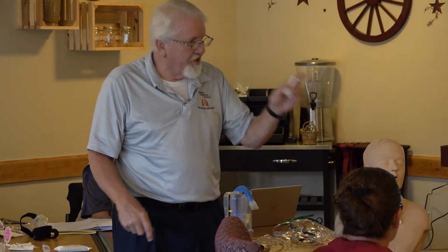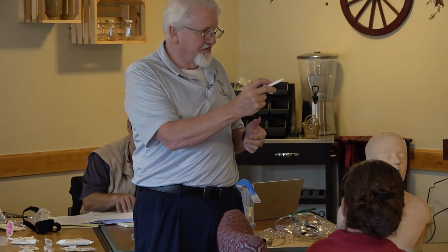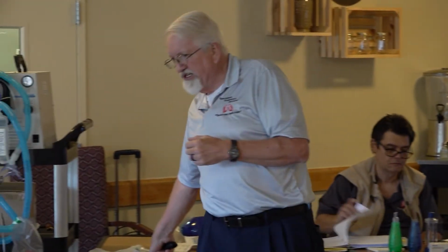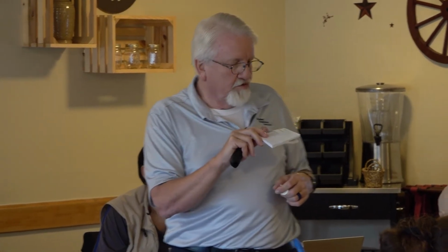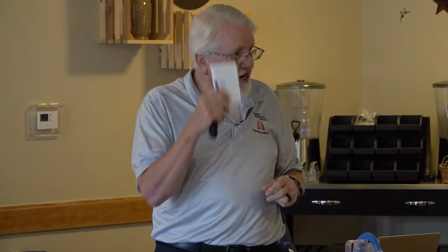And then from that point after, it's just a case of this, and you're going to change your trachs every 29 days. So this is an interesting point, because some physicians say 3 months or whatever. Page 5, when you open the box of any trach, there's going to be a book in there for that particular trach, brand. So in this particular one, on your Shileys, it's going to be on page 5. The suggested time is 29 days. So we typically will go from 28 to 31 days.